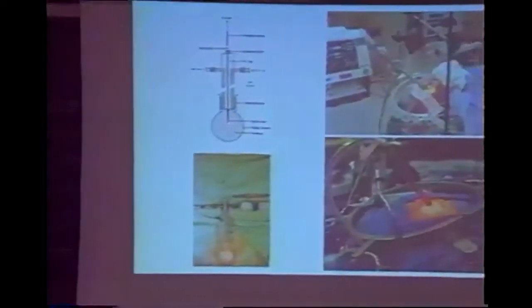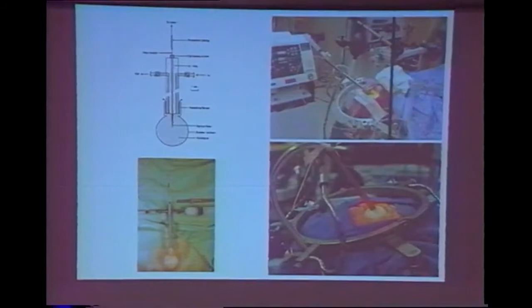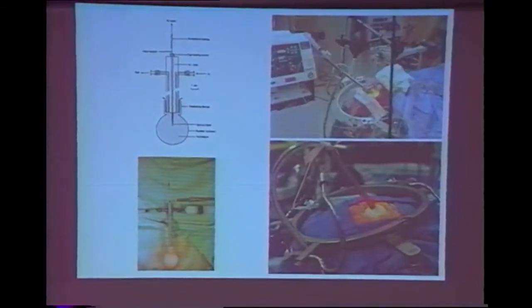So the optical fiber comes down into the center, and the fluid here scatters the light many times so that there's uniform distribution throughout the surface. So this is put into the brain and then inflated with intralipid.